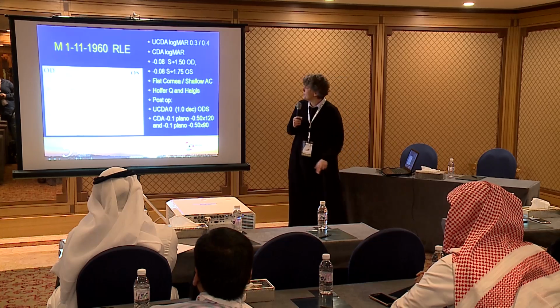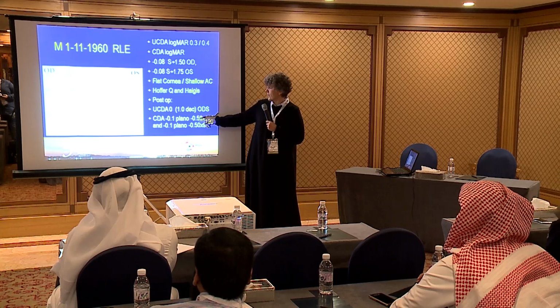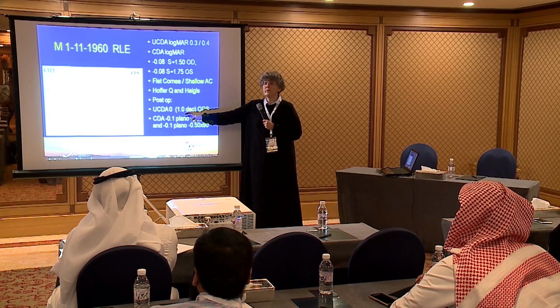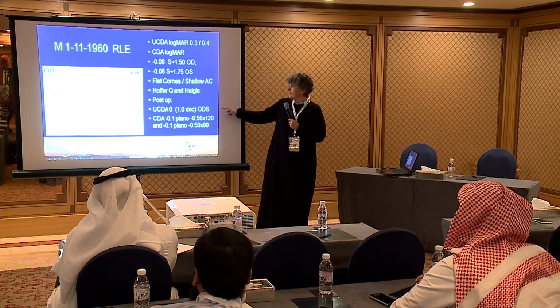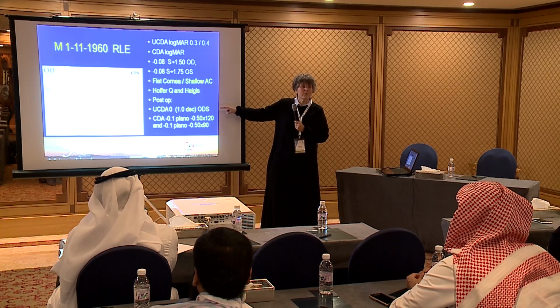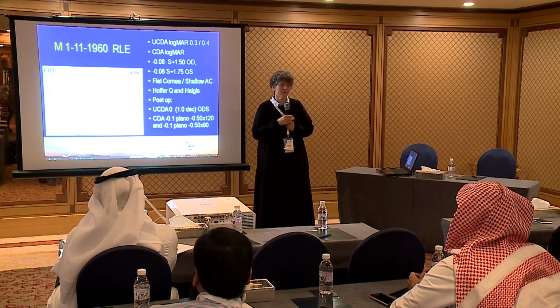So, post-operatively, the result that I got is that we saw a 1.0 decimal without correction, and with a very small correction, plano -1/2 on 120 degrees, we saw 125. That's the logmar, -0.1. Okay? And now this is the part that usually you get a result of 1.0. Why should you check the refraction, right? Because you're right on. But young people can see more than 1.0. And that's why you need to refract in order to be aware of your own results. That's the only way to make the extra step to become better.